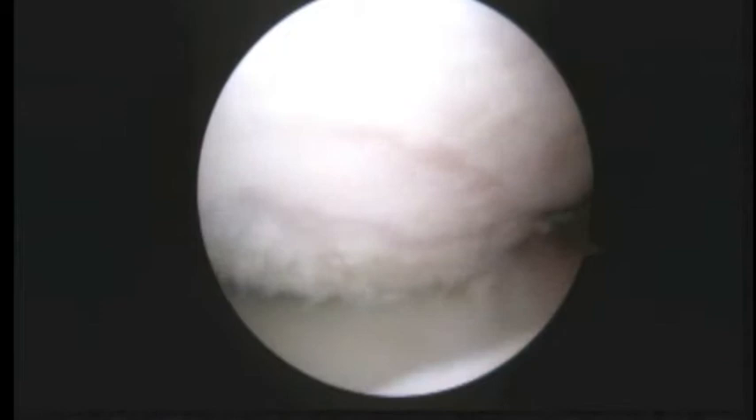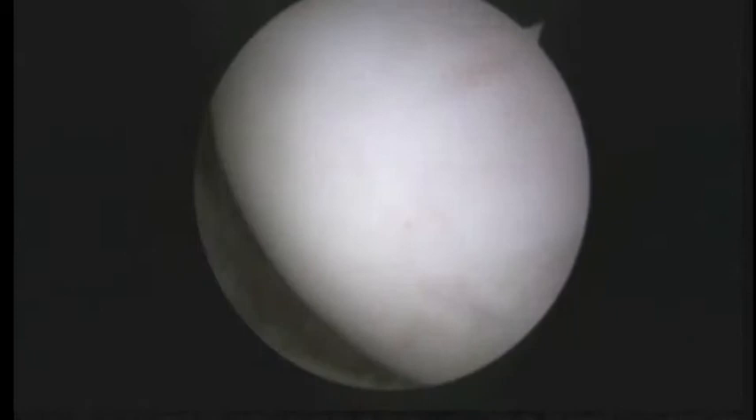You can look down the front of the shoulder and you can see a significant amount of damage — loss of bone in the front. Here's the area of the Hill-Sachs lesion in the back of the humeral head.